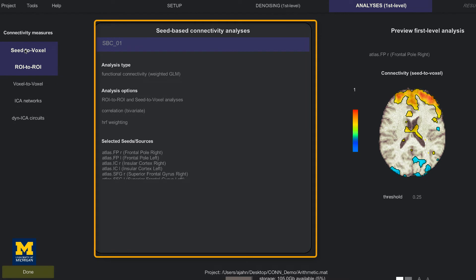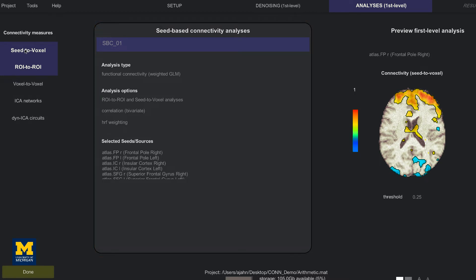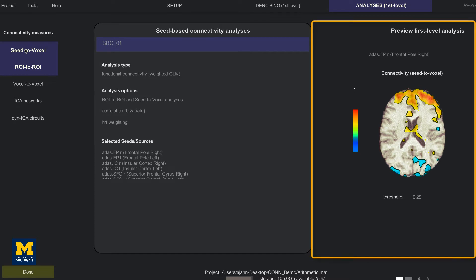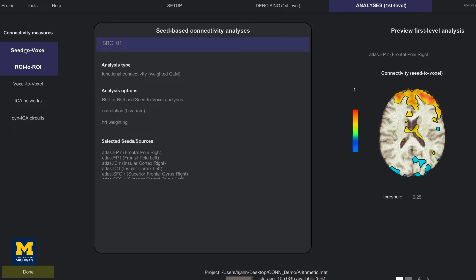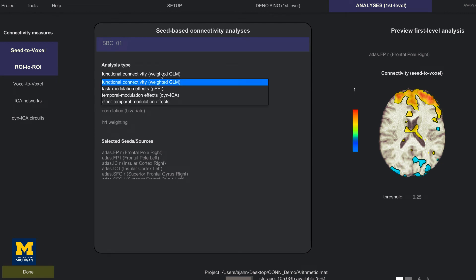The left area, seed-based connectivity analyses, lists different analysis types and options that you can choose from. The right area, preview first level analysis results, shows how the average time series of the currently selected seed correlates with other voxels in the brain. Since we are only looking at resting state data, functional connectivity weighted GLM is the most appropriate option to use. Later on, we will see how to do a generalized psychophysiological interaction or GPPI analysis, which can be used with task-related datasets.